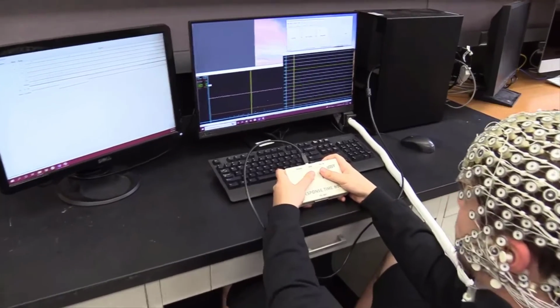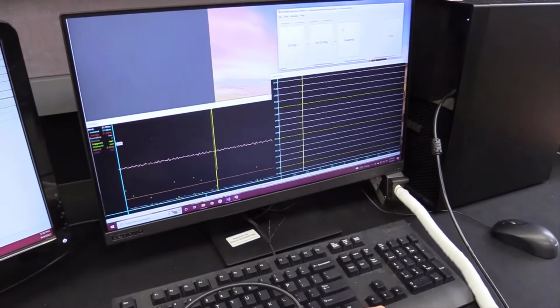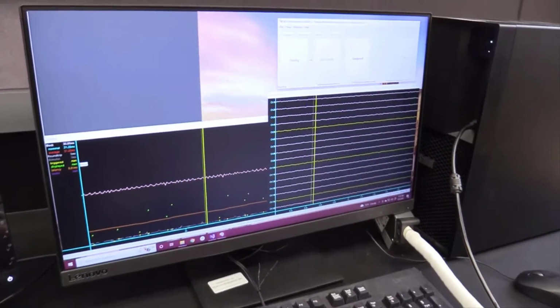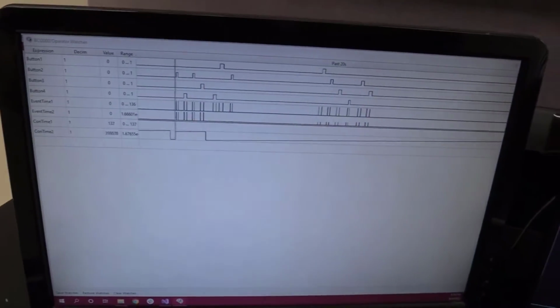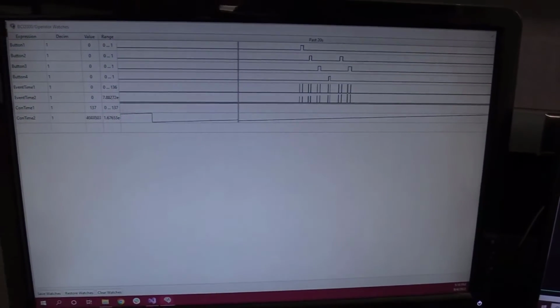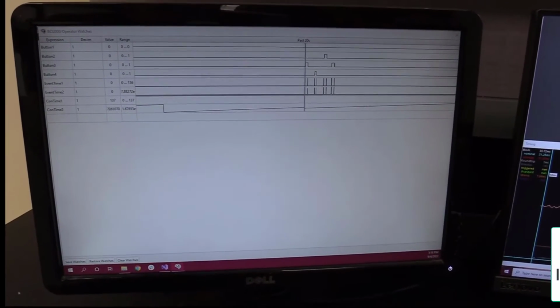Many experiments depend on gauging a subject's reaction time to external stimuli. The Response Time Box, when used with BCI 2000, conveniently synchronizes the subject's behavioral responses with their physiological signals, reducing the burden of data extraction and analysis. Not only is the device easy to implement for the researcher, but the design is also simple and will assist in minimizing distractions for the subject.